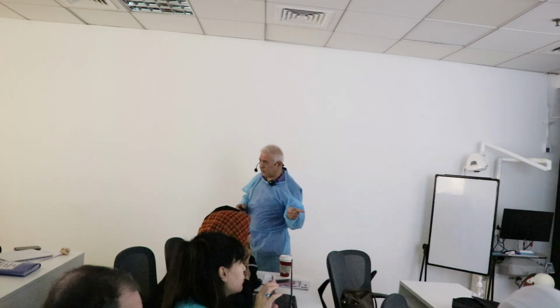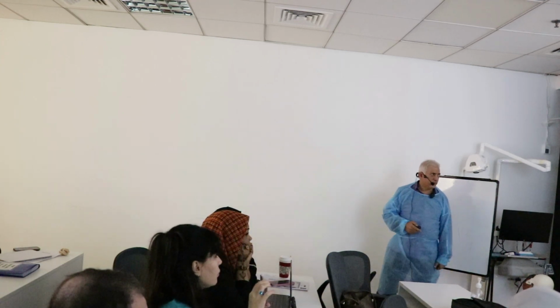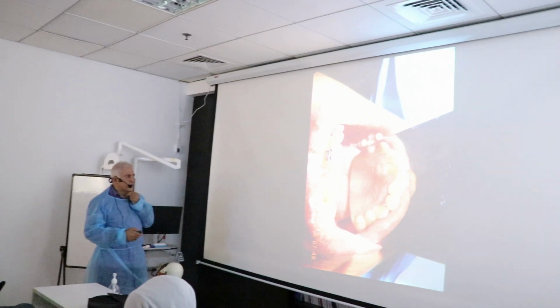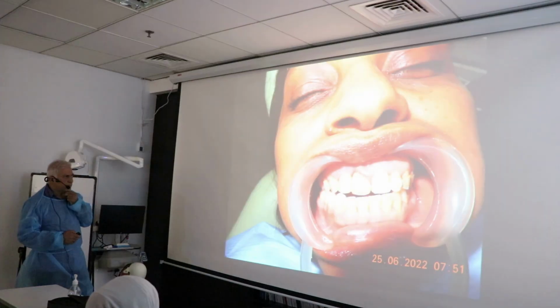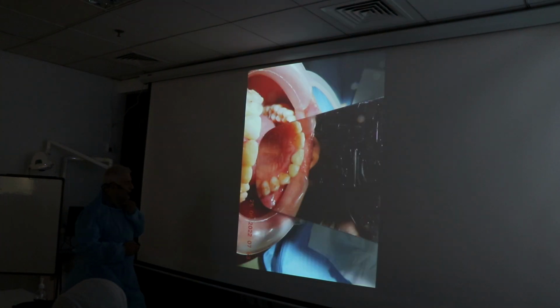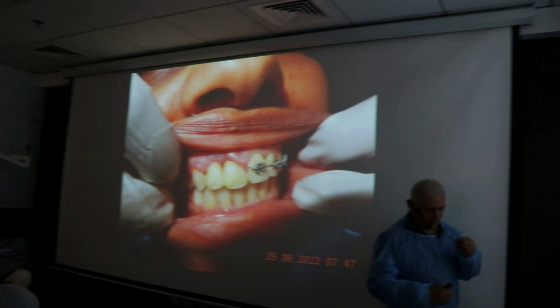There is something I didn't do properly. I was so excited with the immediate loading that I actually did not think like Thomas. I thought like Suhail. All right, so this is the provisional. I kept the position of the existing soft tissue and out of occlusion, of course. So there is no reason to connect it with the neighboring teeth, out of occlusion. And the patient was shocked that she went home on that day without wires. She's extremely thankful.